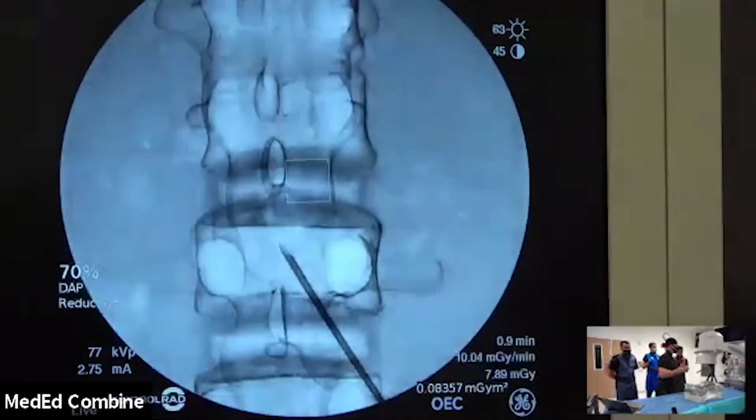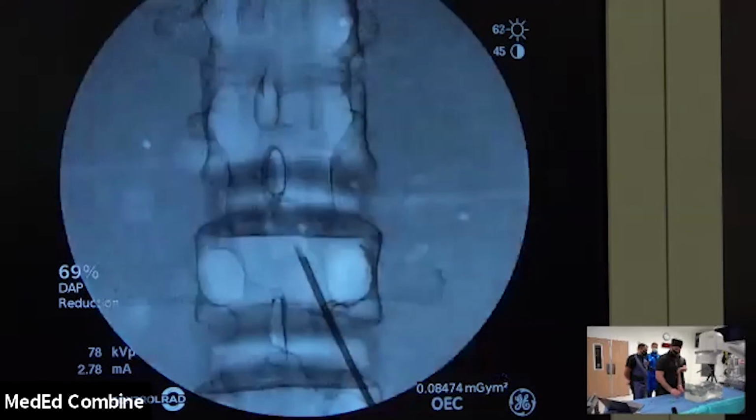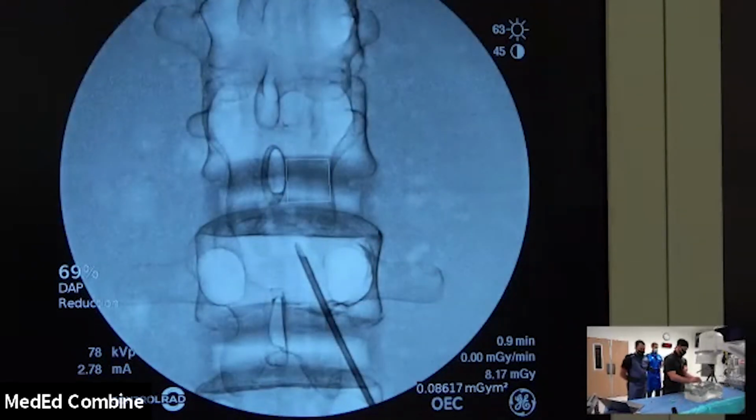See that? And this is how regular trials go. Right off the bone, right in the space. Let's just try to walk this in. There you go. It's just not advancing for me. There's a little bit of an effort you have to make to get this to feel like a good loss of resistance. So I'm still in a good loss. I had to do this just a little bit further.